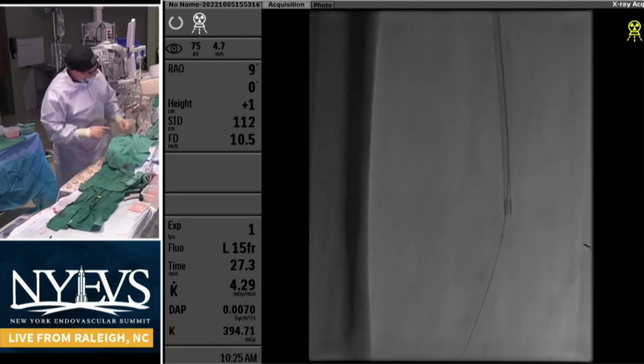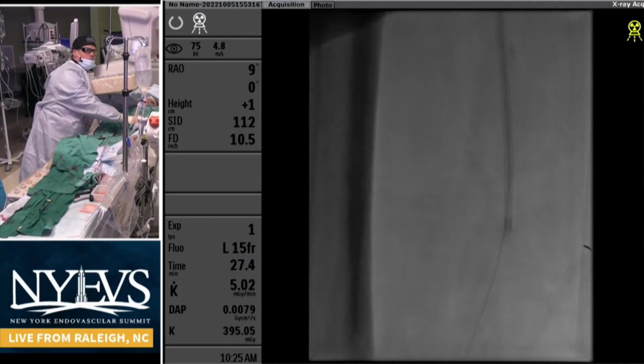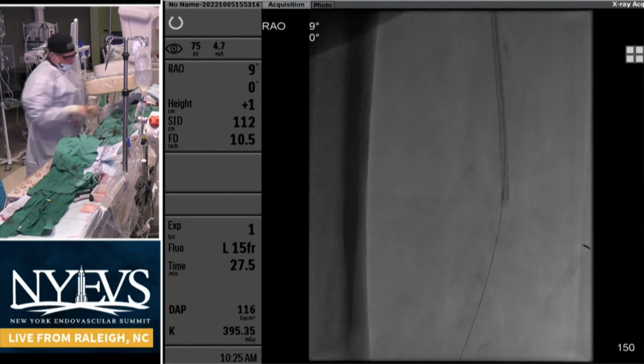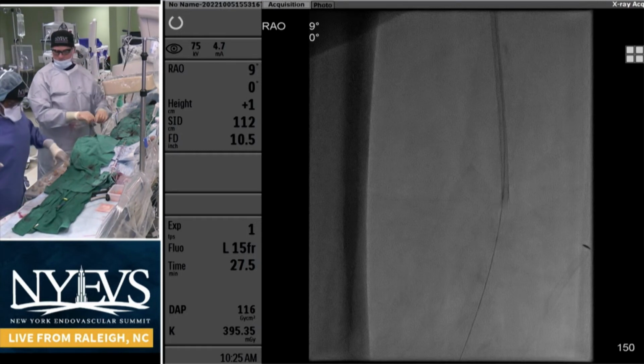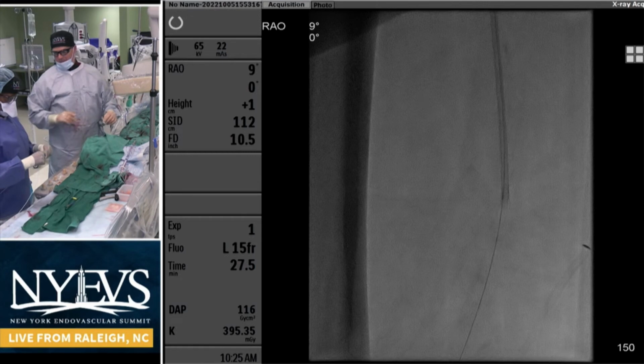Yeah, so that's also one of those techniques you've used in the past where you puncture the needle through the Outback or the Pioneer and actually go into the balloon and use the hypotube of the balloon to really connect to a true lumen. And then like Dr. Adams was talking about, to externalize it and work from the top. So I think that's a good idea.